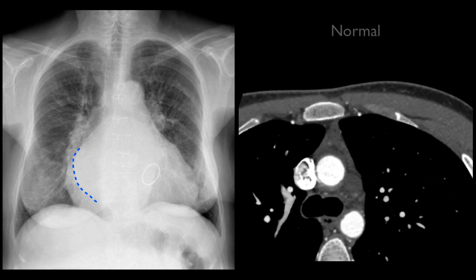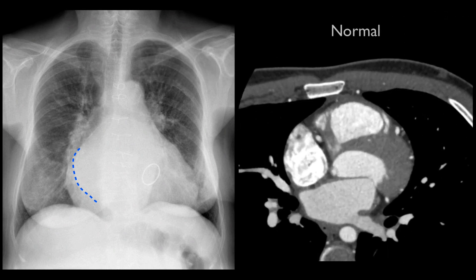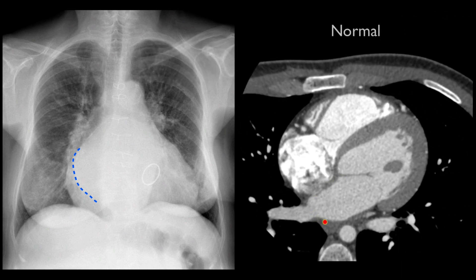If we look at this normal CT for correlation, you can see the posterior location of the left atrium. Here is the left ventricle, the right ventricle, and the right atrium, where there is mixing of contrast arriving from the SVC with non-opacified blood from the IVC. The edge interface between the right atrium and the air within the right middle lobe is responsible for the normal heart border seen on frontal radiographs.